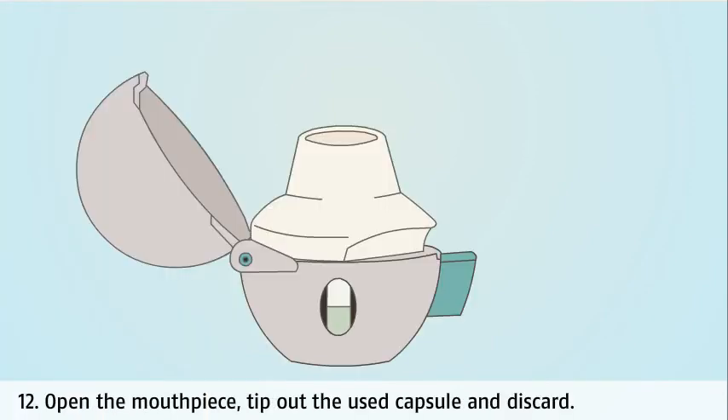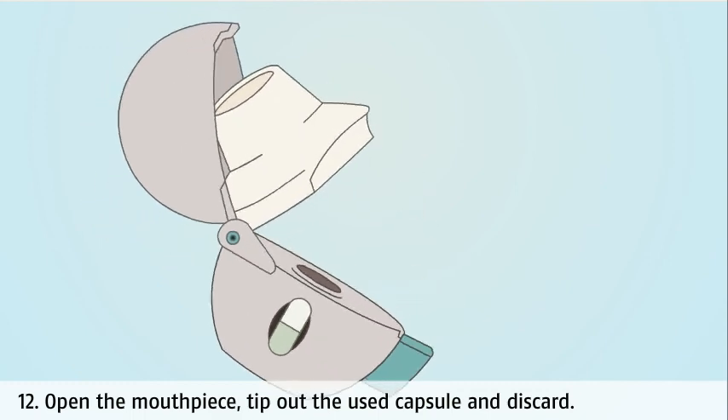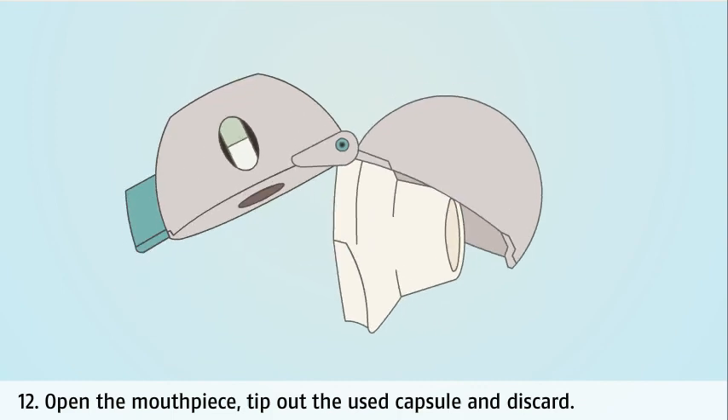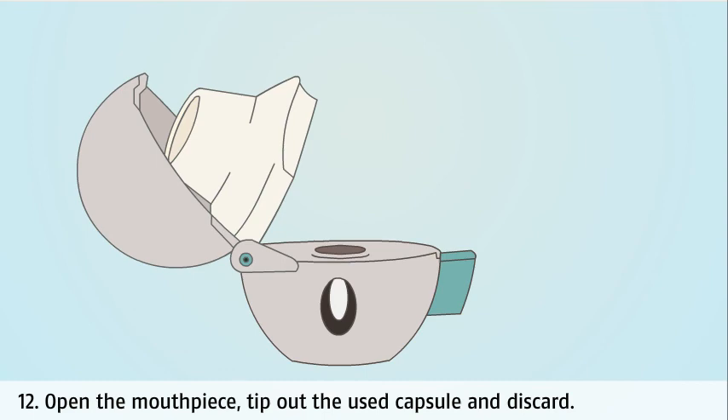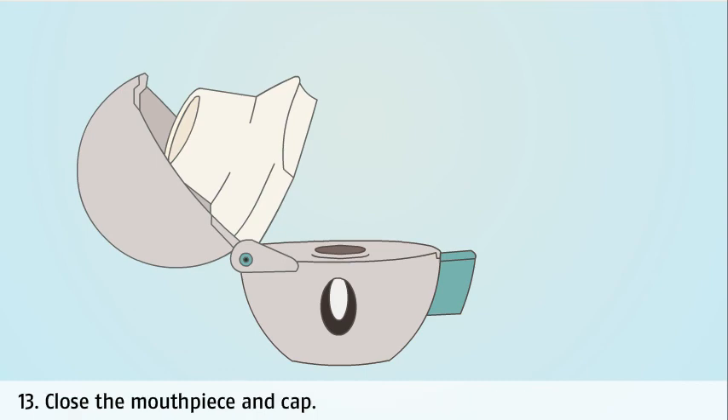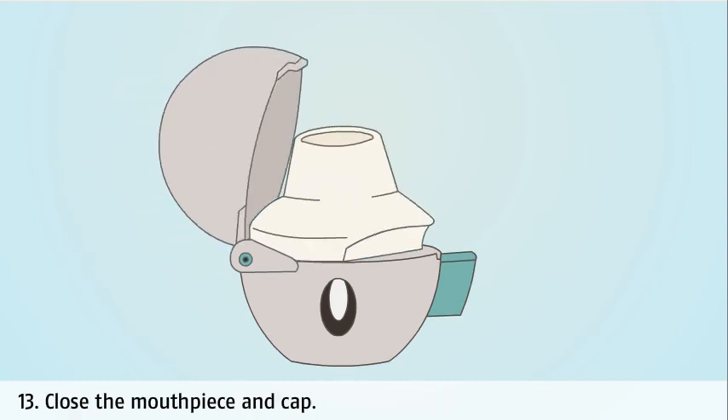Open the mouthpiece and tip out the used capsule. Before you throw it away, make sure you check that the used capsule was successfully pierced and check for any bending of the capsule, which may indicate that a new Handihaler device is needed. If you require an extra dose, make sure the old capsule is discarded and replaced with a new one. When finished, close the mouthpiece and cap.